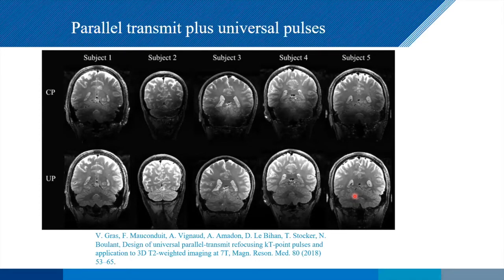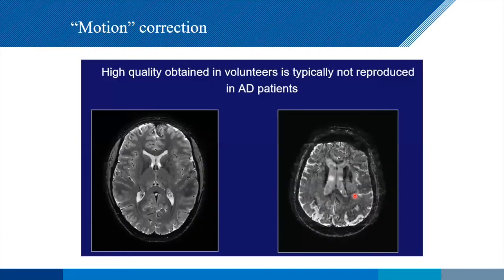Motion is kind of an interesting one. So what we found early on, being in a hospital here, the idea is we do clinical research or we even do patients here. And what we saw was, having put into place all of those improvements over here, we were getting beautiful images in volunteers, and then Alzheimer's patients came in, and you get images like this. And all of the detail, everything you want to do, you want to be looking at QSM, other measures like that, totally impossible because of the image artifacts.